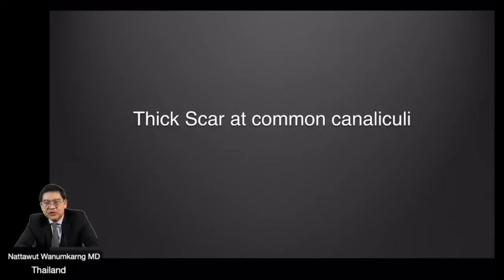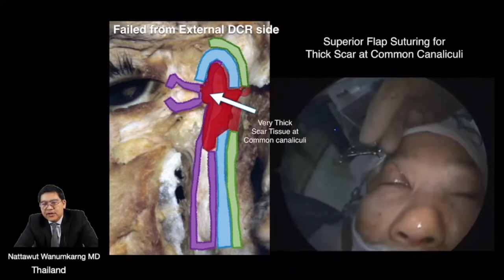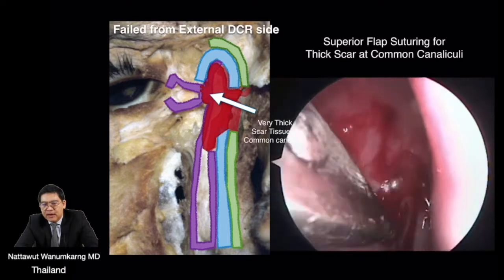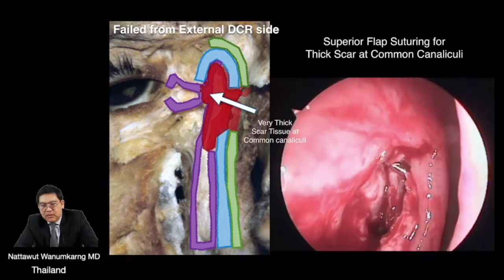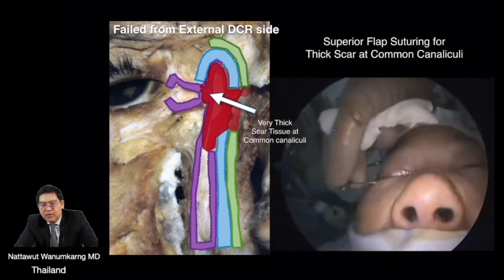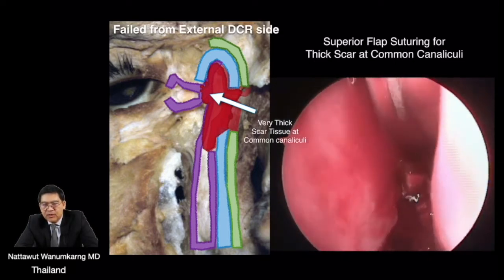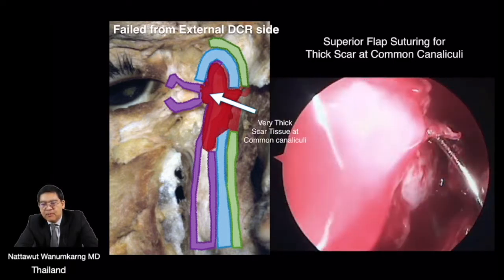For thick scar tissue at the common canaliculi, in this case, it is very challenging to perform revision surgery. After removal of the very thick scar tissue at the area of the body of the lacrimal sac, we can see that the previous surgeon did not remove the upper one-third of the bony part properly. So we have to remove the upper one-third of the frontal process of the maxillary bone. With the simple technique of the chisel and mallet, we could remove the bone properly.